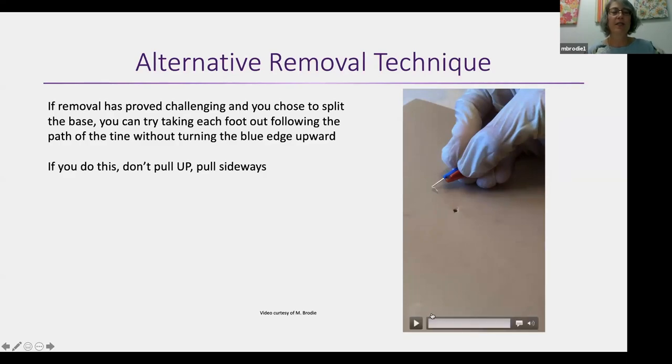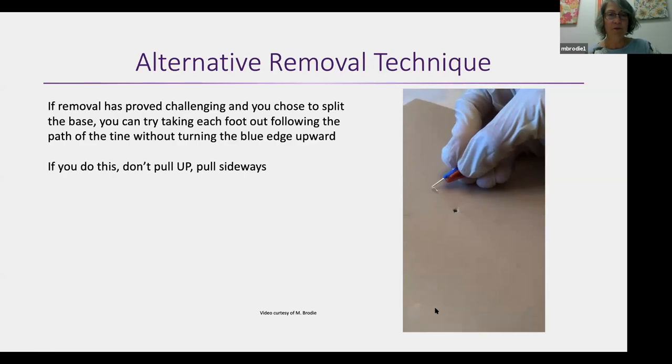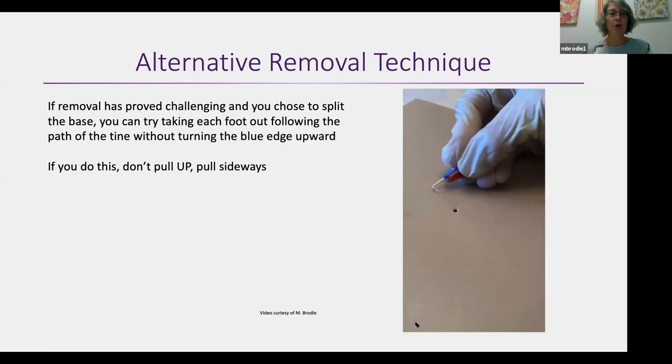And for ones that are particularly stubborn, and for the gentleman in the previous video, that is the method that I used. So you wouldn't pull up if you're not having the blue to the sky. You wouldn't pull up because that wouldn't put the tine in the correct position. You would pull sideways. And again, it's a swift motion to try and get that tine out quickly.